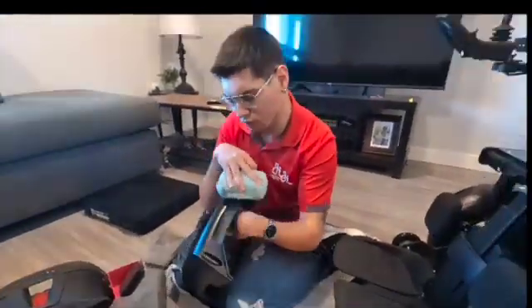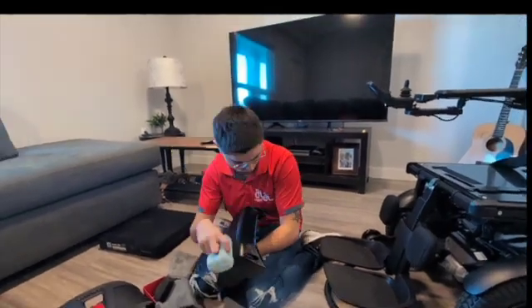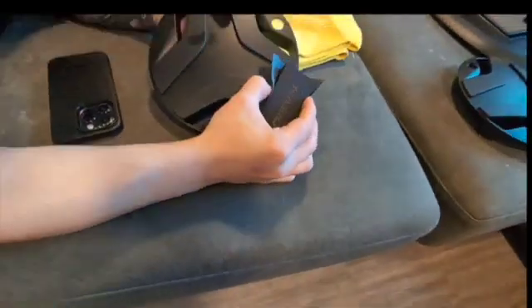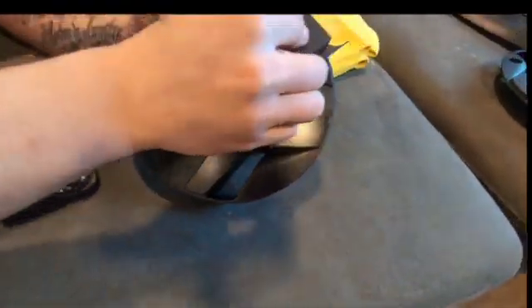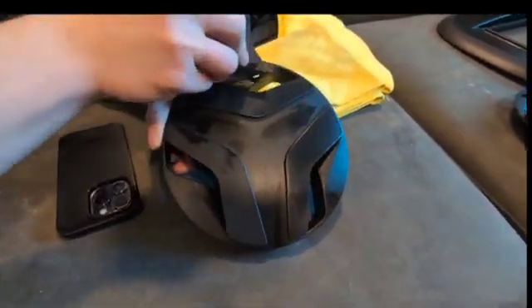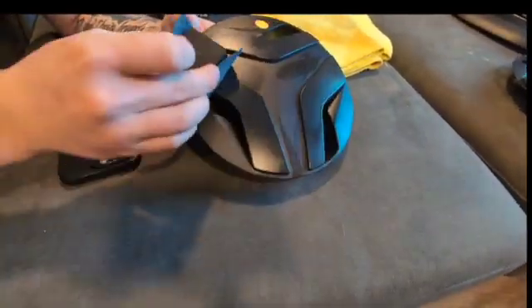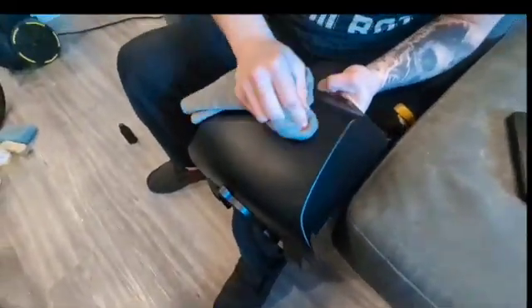This Nasiol coating came with a little foam applicator block and a micro suede towel or whatever you want to call it. But for my hands, that was pretty difficult to hold. So as you saw in the video, I was applying it with a microfiber applicator because it was easier for me to hold. Because the parts were kind of small to hold and that was a tight area, I decided to get my employee to help me ceramic coat most of the chair.